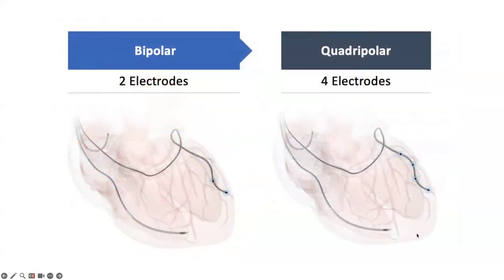On that note, since we're talking about implanting as well, when you're in the procedure itself, you can take into account phrenic nerve stim, where it's occurring, thresholds, where you see the best thresholds, and long-term lead stability. So it's a larger conversation. If you have a really big drain pipe of a vein, and you only have viable capture at the tip electrode, that means if that lead pulls back, it is essentially useless. And LV leads are the most likely to pull back of any lead, and in a big vein it's even more likely. But if you have decent capture here, not great capture here, but viable capture over here, then if the lead pulls back, you still have electrodes in viable tissue.